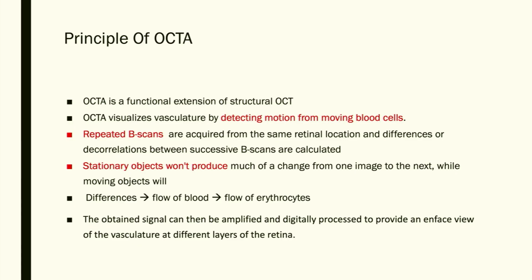So it is a particular threshold between which it works, and it works on the principle that if scans are taken at repeated regular short intervals, then the only change which is there is the change in the movement of erythrocytes and the blood flow, and the OCT angiography picks that up. That is the nutshell of OCT angio.